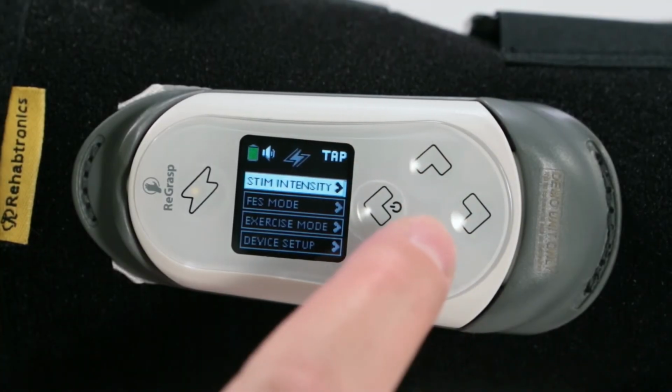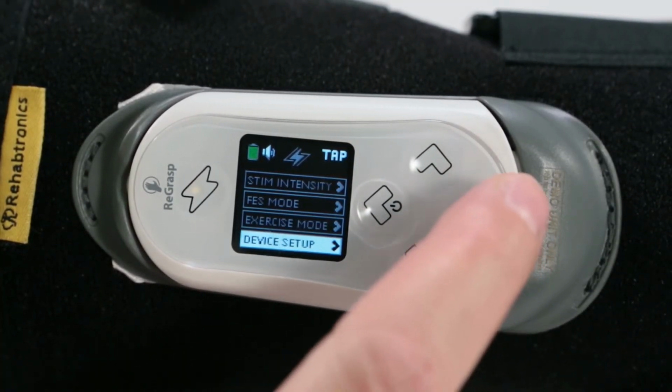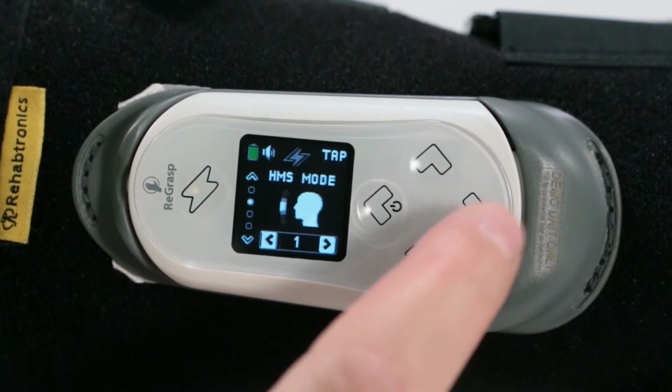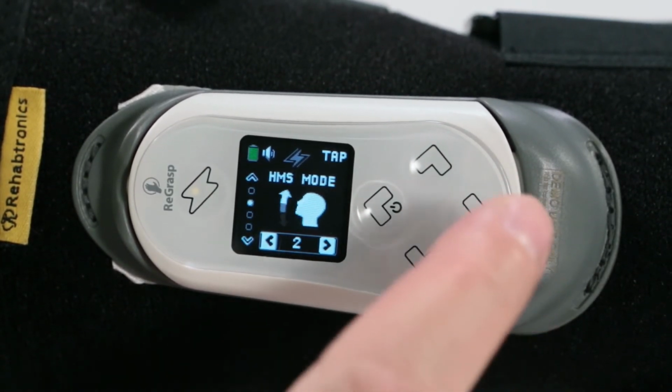To select which head motion you want to use, select Device Setup from the main menu. Scroll down until you reach the head motion sensor. You can select which motion you want to use by scrolling left or right.